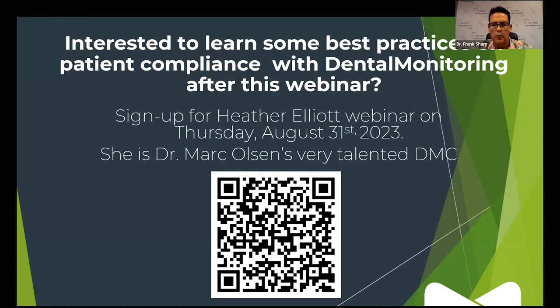We tend to use DM on demand for our braces patients in the beginning. And then when we get into elastic wear, there's no reason to have the patients come in and have the doctors check when we can see how their bite correction is going, and we can set their goals on their patient dashboard. If they need a power chain or O tie changed, it allows us not to have to see that patient. They can come in on one of our non-doctor days where the staff is here. It gives the staff something to do on those days as well.